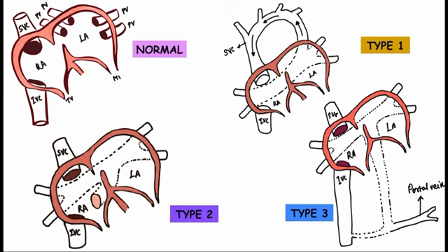Another important point to notice here is the direction of flow. This is away from the heart, whereas this is towards the heart. Note this. This carries some clinical significance. We will say that later.